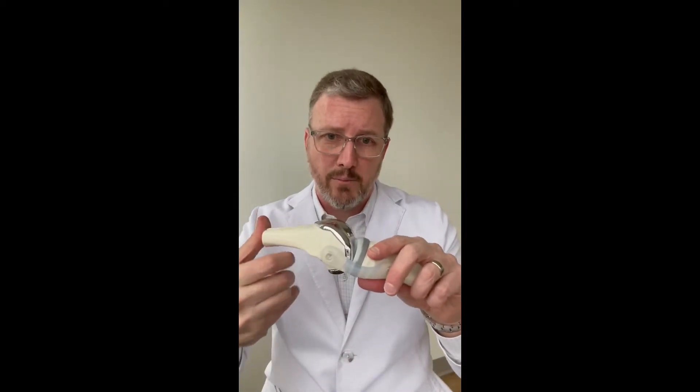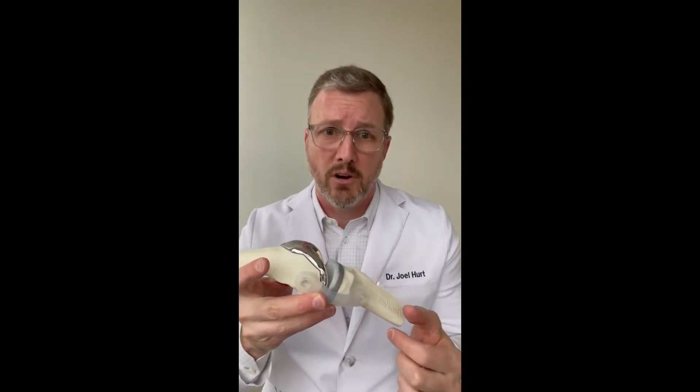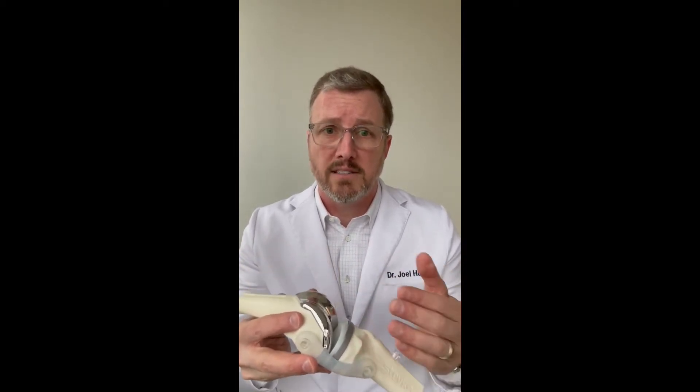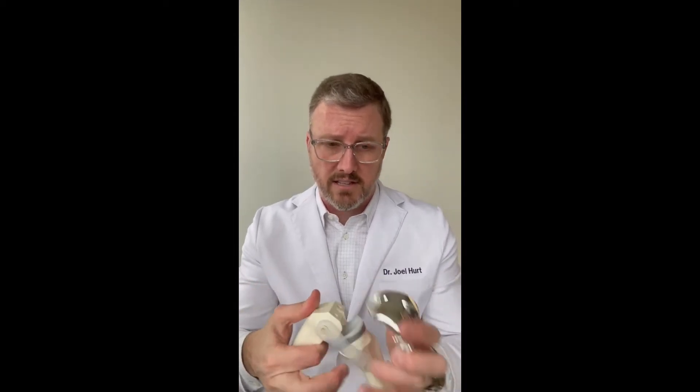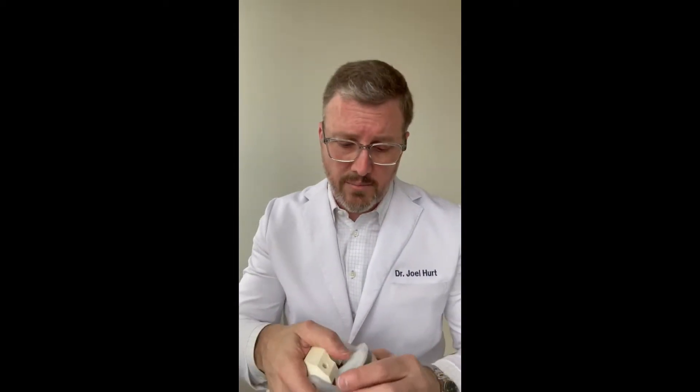You're not cutting the end of the femur off. You're just resurfacing about eight millimeters of bone on both sides. And you make fairly typical cuts no matter the brand of knee replacement. I'm going to take the femur off and the tibia off so you can see what the cuts look like.